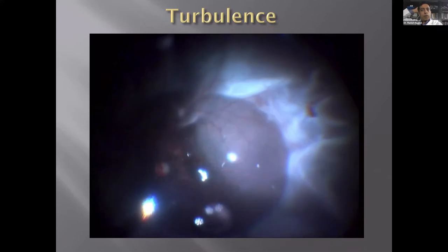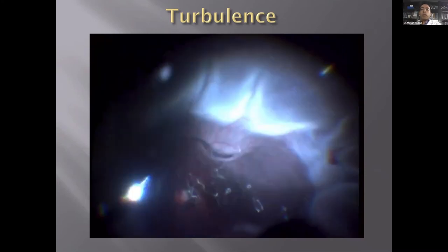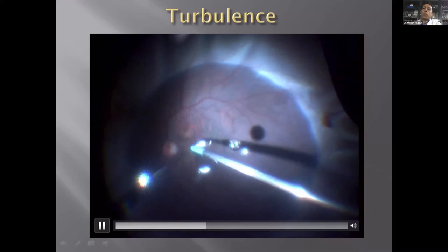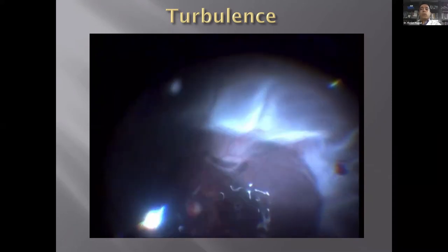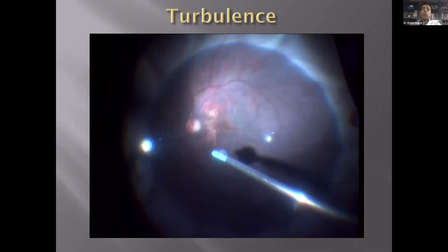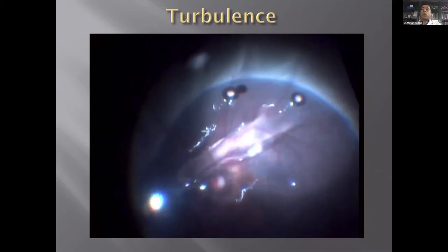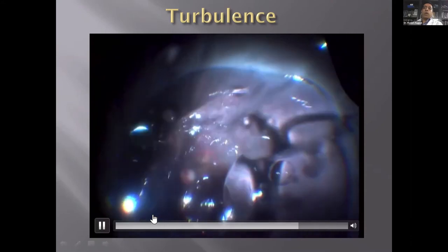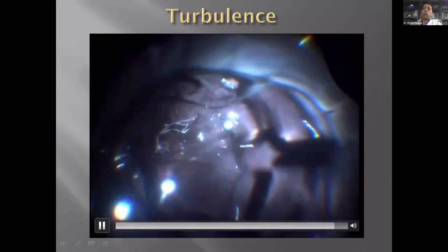I want to discuss the value of valved cannulas. This is a non-valved cannula — in detached retina its effect is most obvious. There's PFCL inside, and as soon as an instrument is pushed in, everything quietens, but when removed, there is significant turbulence. This is not good for the eye — it could push PFCL into the subretinal space through breaks, especially with giant retinal tears. I always prefer to use valved cannulas through all surgeries, which maintains a very good non-turbulent vitreous cavity throughout the procedure.